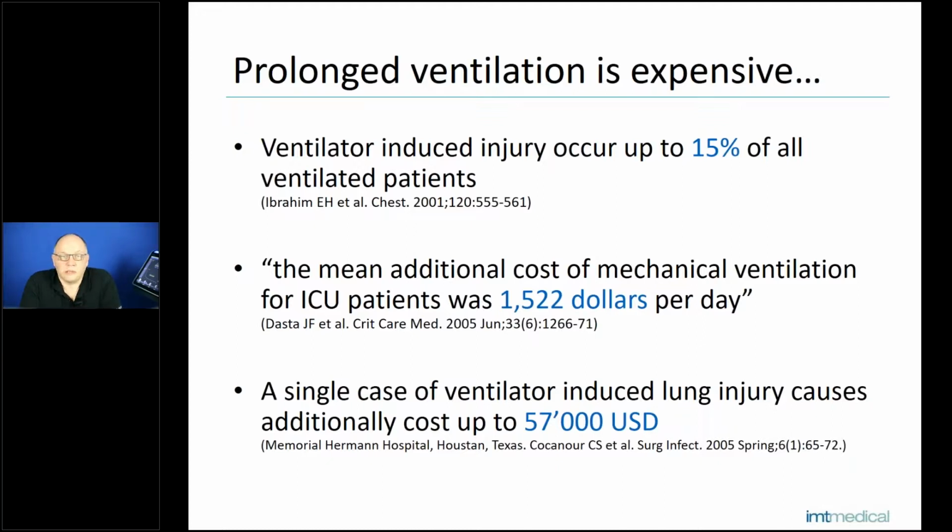Okay, now we really start with the ventilation. By starting with AVM, there are first 3 test breaths with 15 centimeters of water just to measure out the lung condition. And after 3 breaths, we have all the data we need to adapt the ventilation directly to the patient.